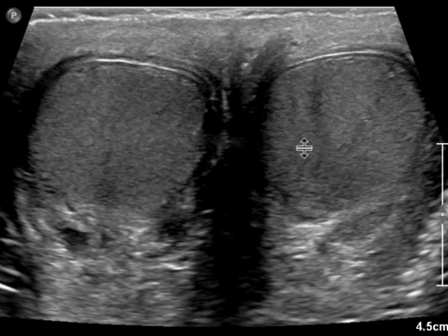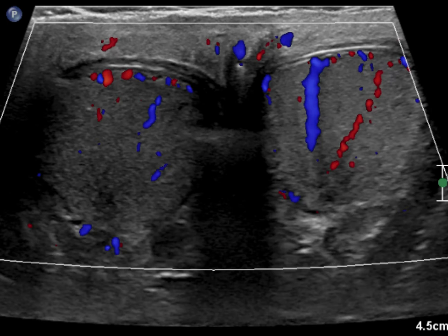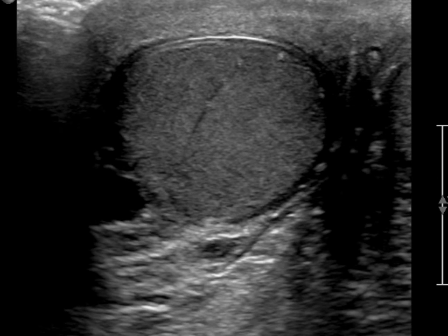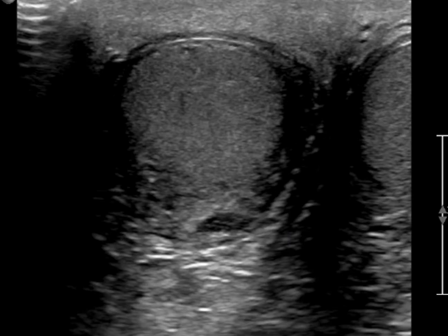This is a patient who came with right scrotal pain, and we got an ultrasound to further evaluate. Gray scale images of both testicles look within normal limits.